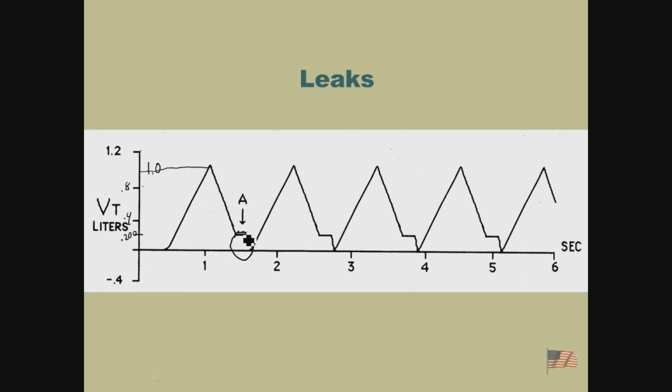I can quantify how much leak I end up having. What is being put in is 1.0. What is being exhaled is only 0.8. So there's a discrepancy of 200 milliliters.